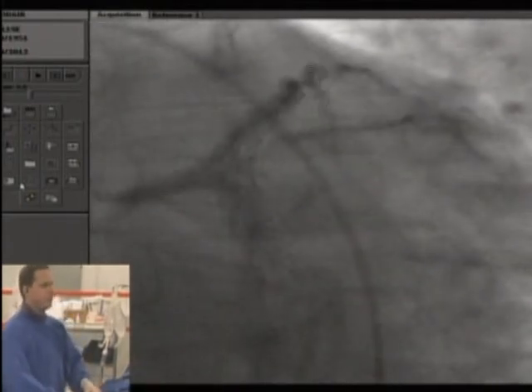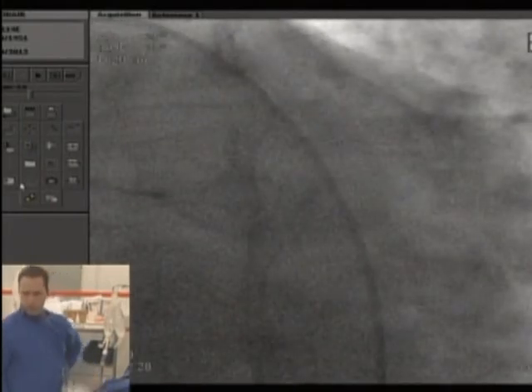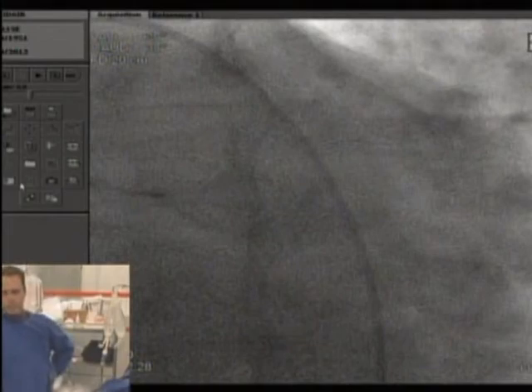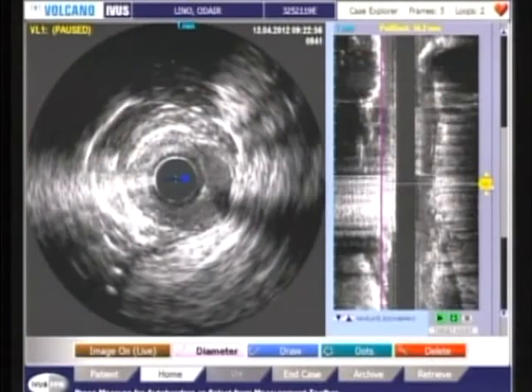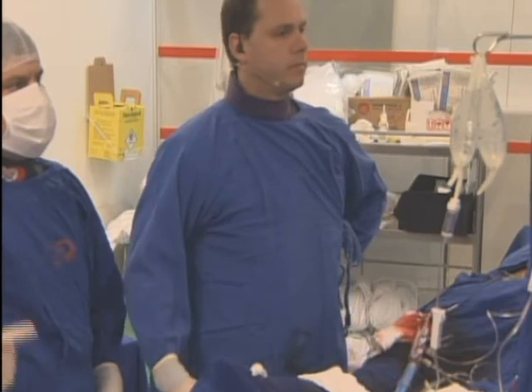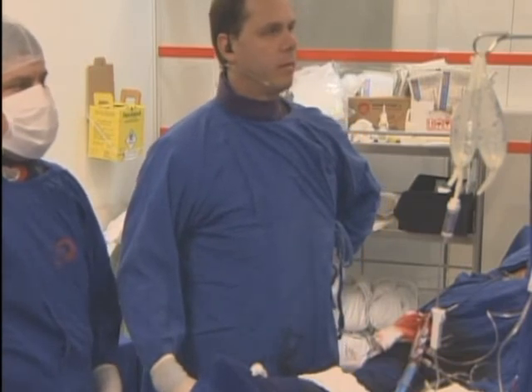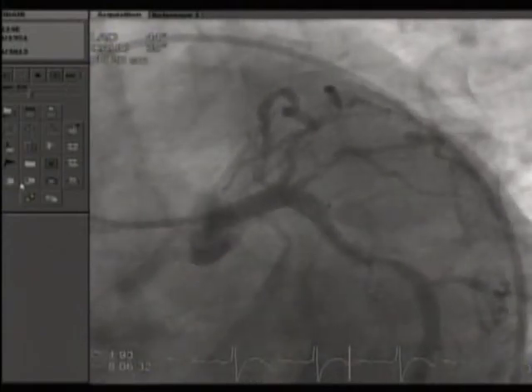Would you agree with that? That's great. Yeah. When it goes beyond the stent boundaries, I have to say that generally, a drug-eluting balloon wouldn't be my first choice. When you have a more focal lesion, or mainly when you need more expansion, you do aggressive pre-dilatation and then just put a drug-eluting balloon to massage and perhaps to deliver drug. But when it's proliferative like that, I think you might be committed to another stent. Any different comment? Ricardo? Another stent. Miguel? Another stent, right? Yeah, another stent.